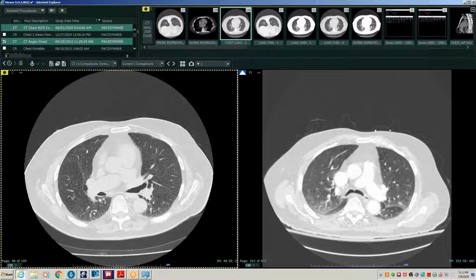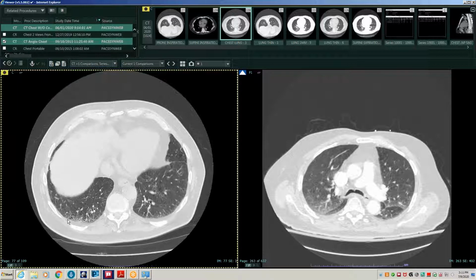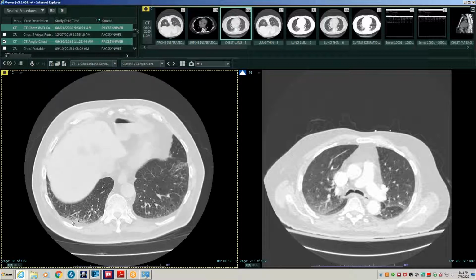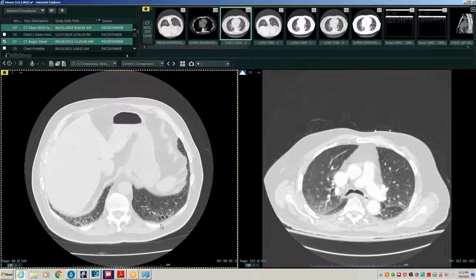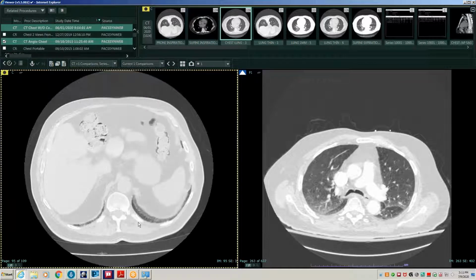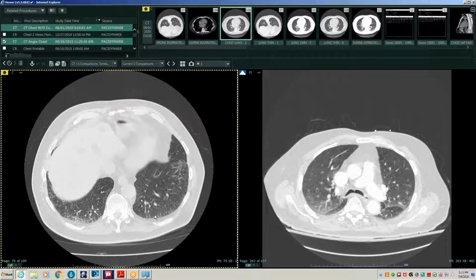And I guess a separate question is, does he have early pulmonary fibrosis that we should worry about because he's in his 80s? There's some dilated airways down in here, I think. But no convincing honeycombing. So the pulmonologist's question to me was, do I think this is LIP, and should he stay on the mycophenolate that he was put on in January?